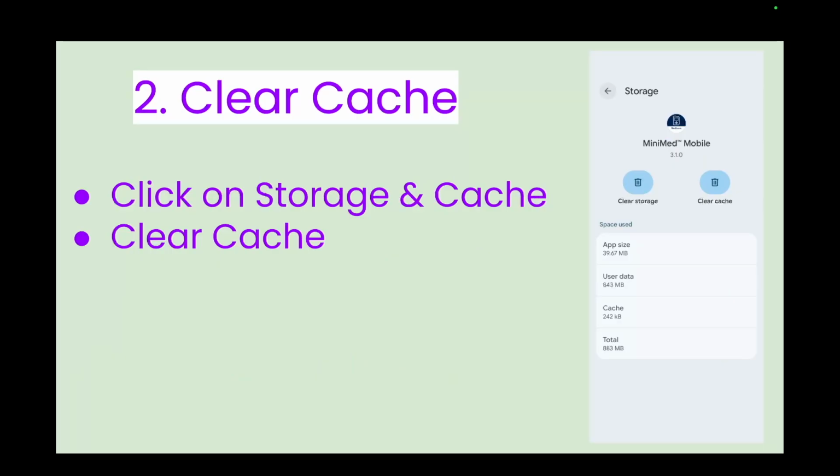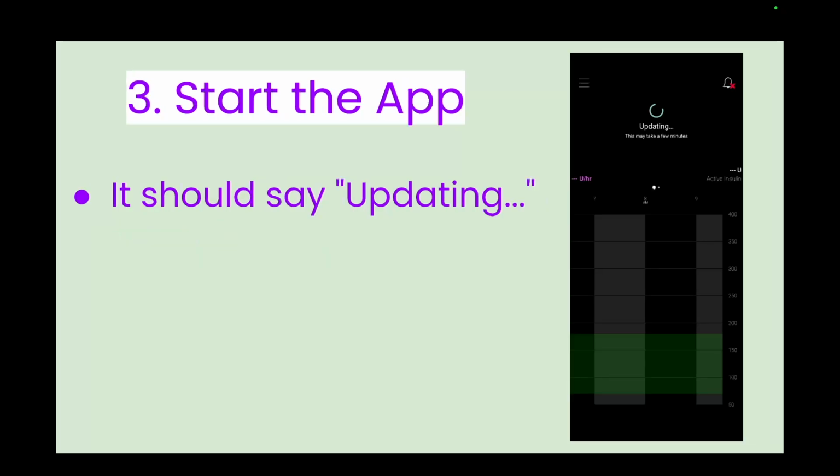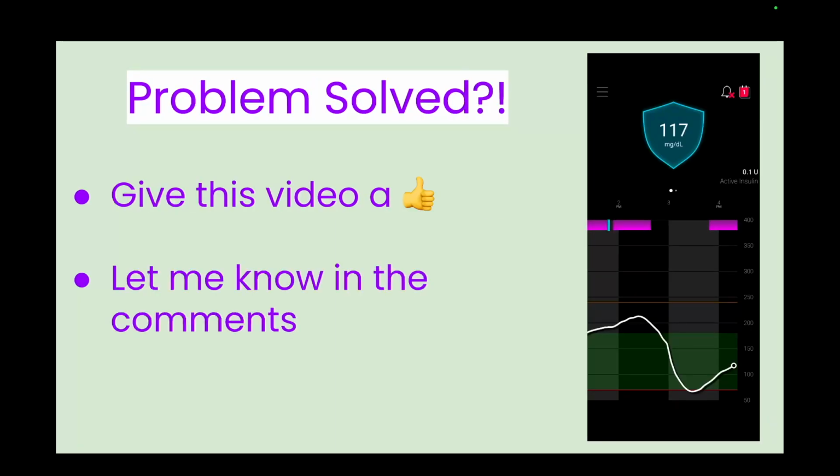Number two, clear the cache. Click on storage and cache and click on clear cache. Number three, now you are going to restart the app. Find that app in your app list and click on it, and hopefully it will open up and it should say updating. Did that solve your problem?